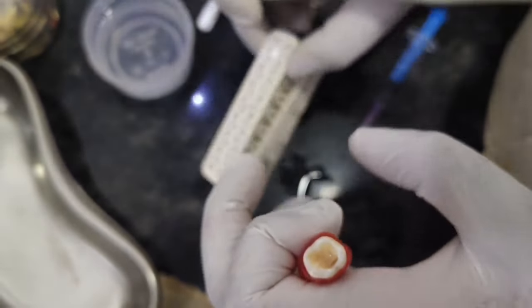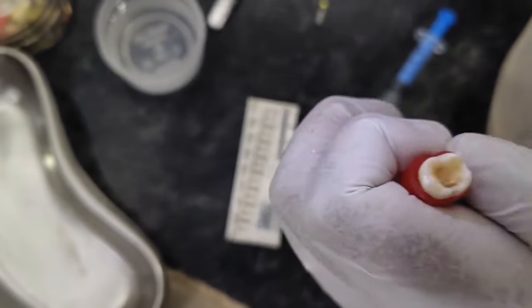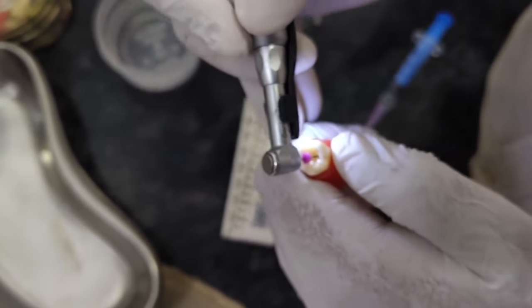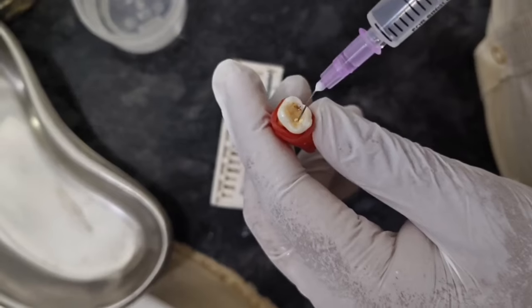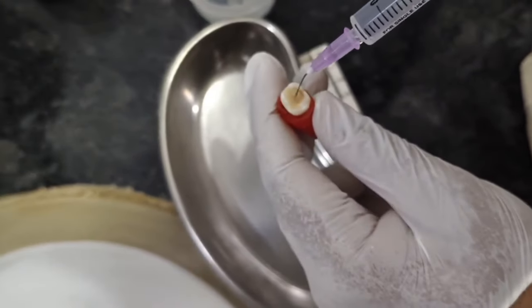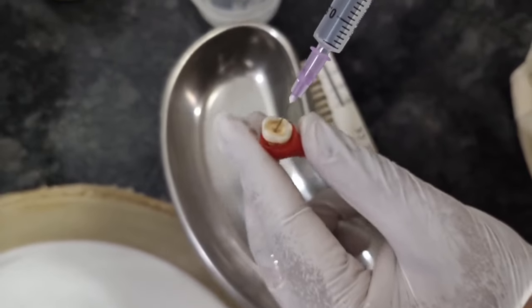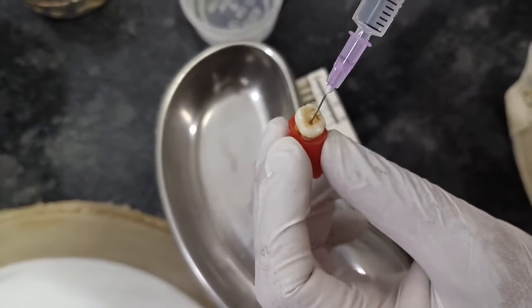Before inserting in each canal, you have to see the measurement, the working length, which we have already checked, was around 18 mm. Now we are putting in the mesiobuccal canal, you can see. Now we will irrigate the canals with sodium hypochlorite solution. While irrigating with sodium hypochlorite, make proper isolation, otherwise tissues are going to burn and the patient will have difficulties in eating and chewing, and he or she will come back to you complaining of pain.